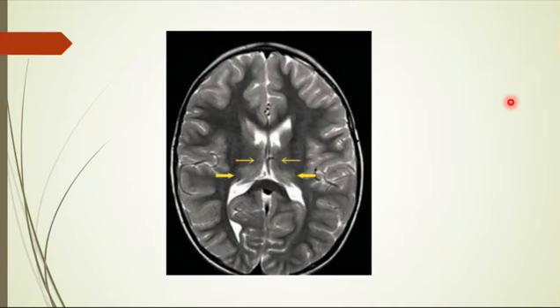So that's a very uncommonly seen one, and I don't think any of us have seen it before and I don't think we will see it after, but we need to know about it. This is what's called the hockey stick or the pulvinar appearance. Okay, so what do you think? Creutzfeldt-Jakob disease. Yes, exactly. It's the mad cow disease.